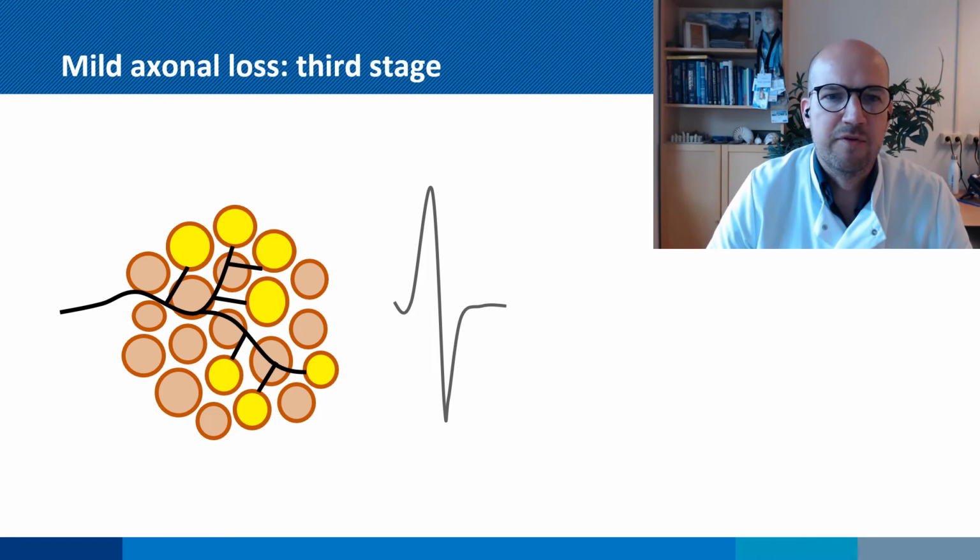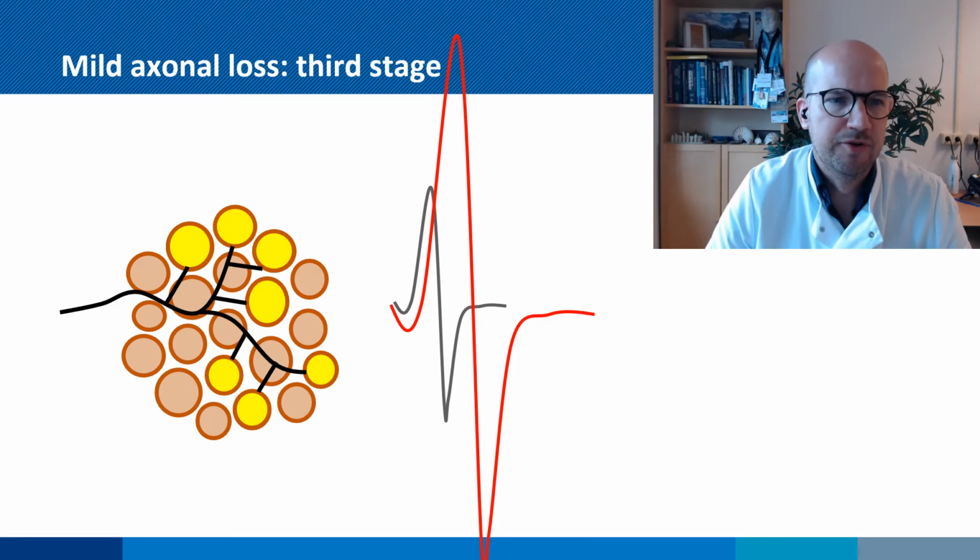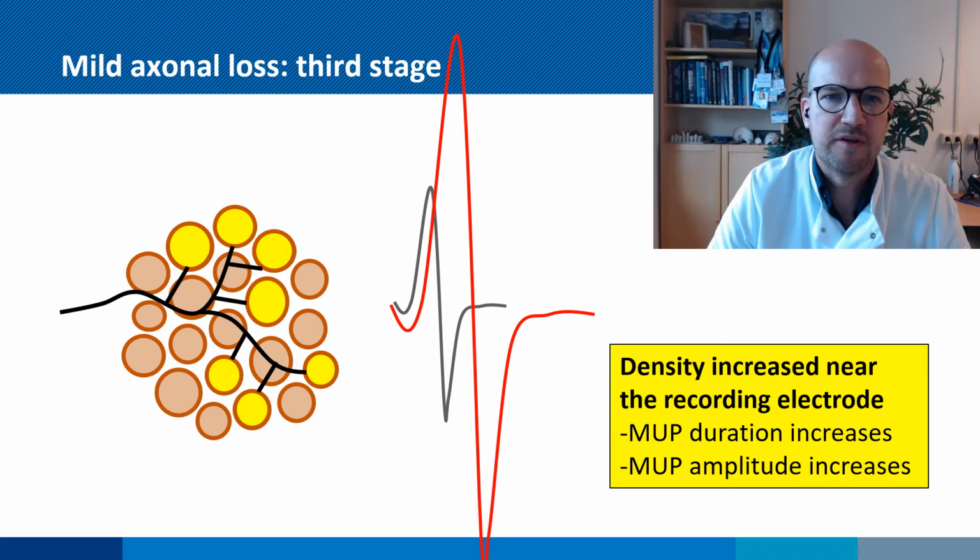Note that the amplitude of the MUP is also strongly influenced by the position of the needle relative to the motor unit, whereas the duration is not. This is why MUP duration is considered to be a more reliable indicator of prior nerve injury than amplitude. Although personally I feel that both can be evaluated reliably, and amplitudes are slightly easier to judge in a live recording. Nonetheless, probably best to look at both parameters.